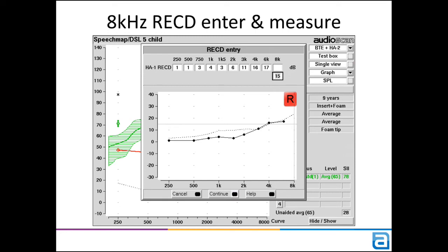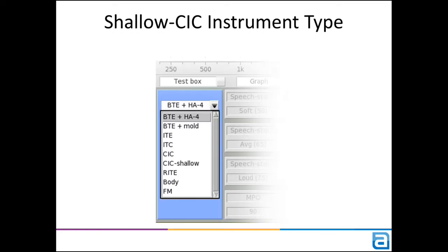We've also added CIC shallow as a new instrument type. When running SpeechMap in the test box, the instrument type determines the RECD type applied to the coupler microphone, and which microphone location effects are applied to the stimulus. When CIC is selected, an additional correction for a deep insertion is also added. Since many CIC instruments do not extend that deep into the ear canal, the CIC shallow instrument type removes that additional correction.